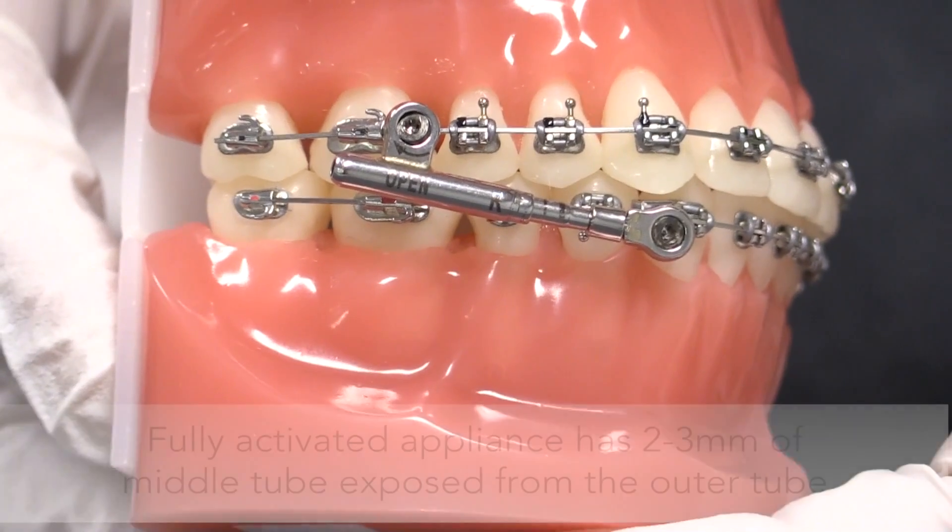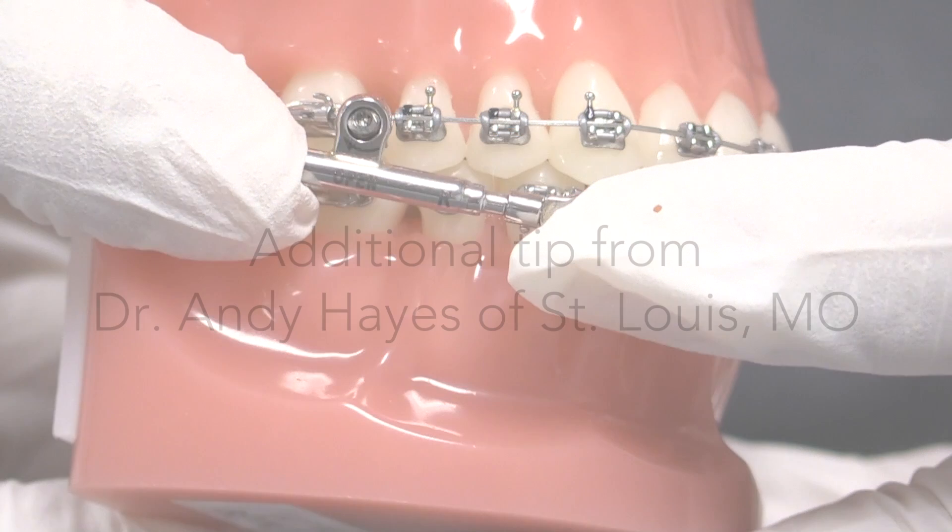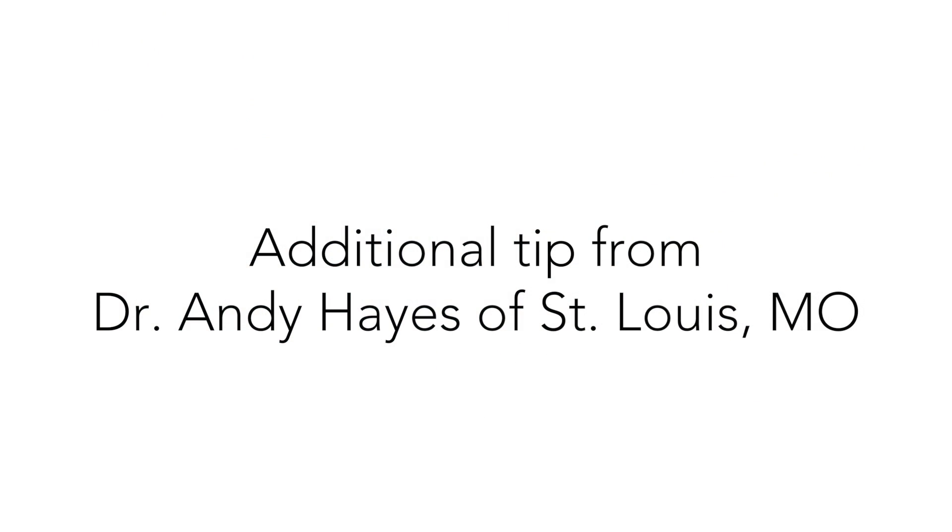Please note that a fully active PowerScope II appliance will have 2 to 3 mm of the middle tube exposed from the outer tube. It's worthy to note that depending on the severity of the Class II or the size of the dentition of the patient, it may be necessary to activate the PowerScope right at the initial installation appointment.